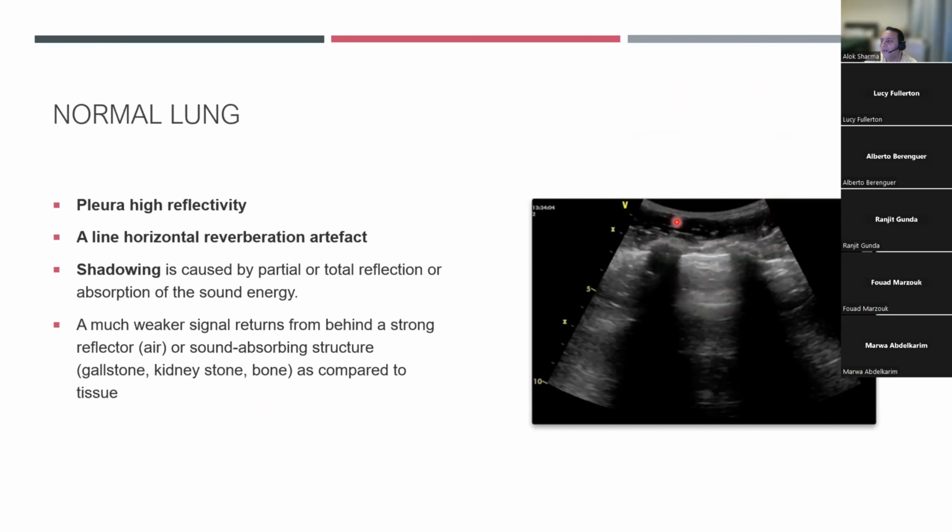But over here, they're going to reflect back because bone has a high density, but also because the acoustic impedance between this soft tissue area and this bone is quite high. There'll be maximum reflection in these regions. So sound waves won't penetrate at the back over here, and you will get these areas of dropout, which we call acoustic shadow.